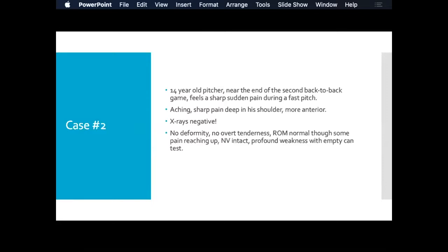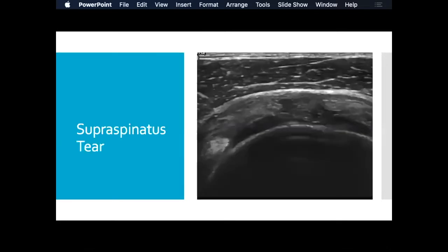So next slide. This is a supraspinatus tear. This is a good example of anisotropy versus actual ligament disruption and fluid. On the rest of that image, the ultrasound probe is directly on the tendon, and you have a nice crisp image. Anisotropy will oftentimes give you a gradual transition from good tissue to dark.